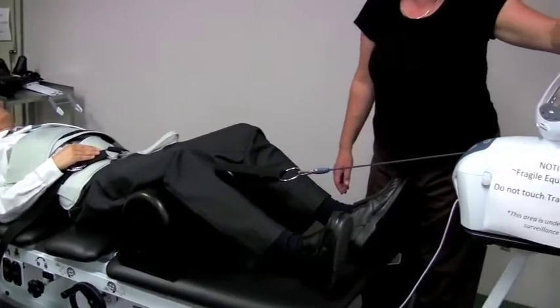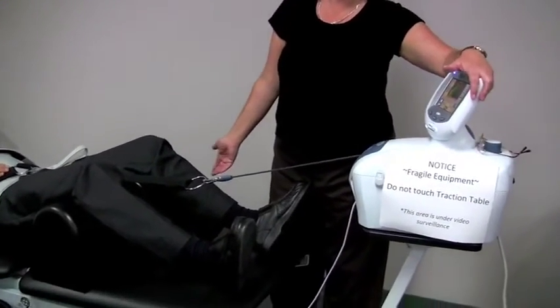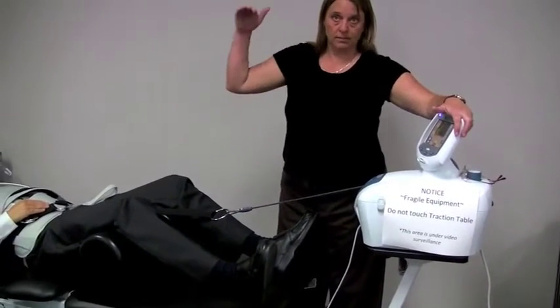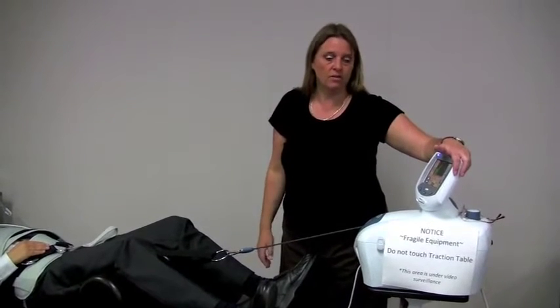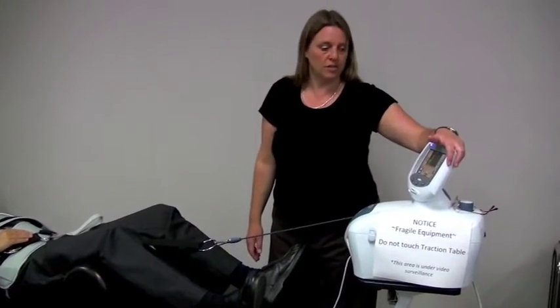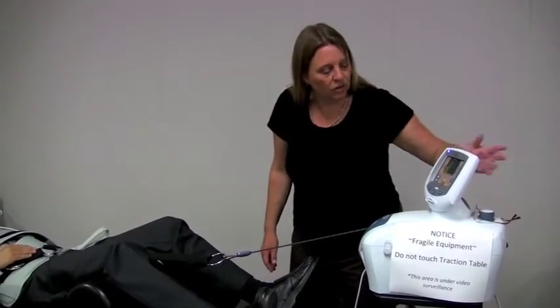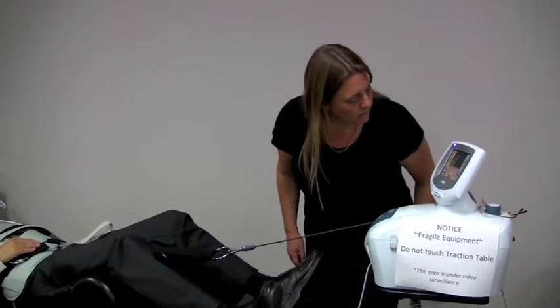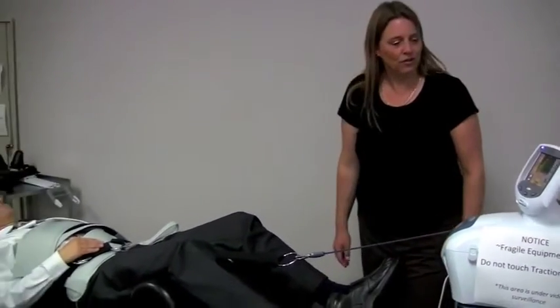The other thing you can do is you can always change the maximum during the treatment. Start with the 25% of the body weight as your maximum and bump it up to work with your patient. Never go more than 150 pounds on a lumbar spine. Of course, that's really dependent upon the size of the patient. Okay, so let's go ahead. I switched it back to 30. You have very few minutes remaining, probably about 30 seconds to go.